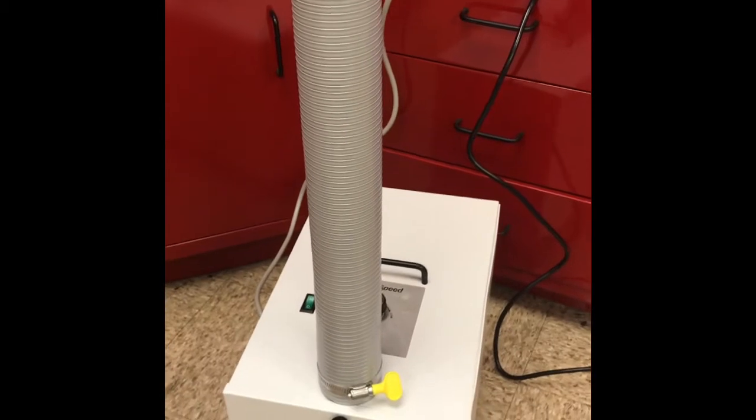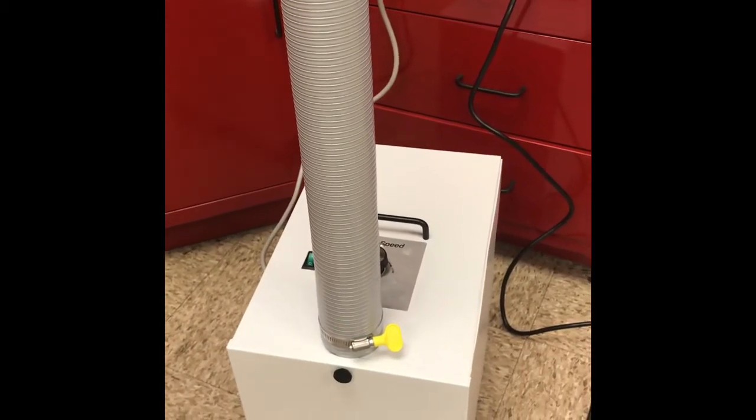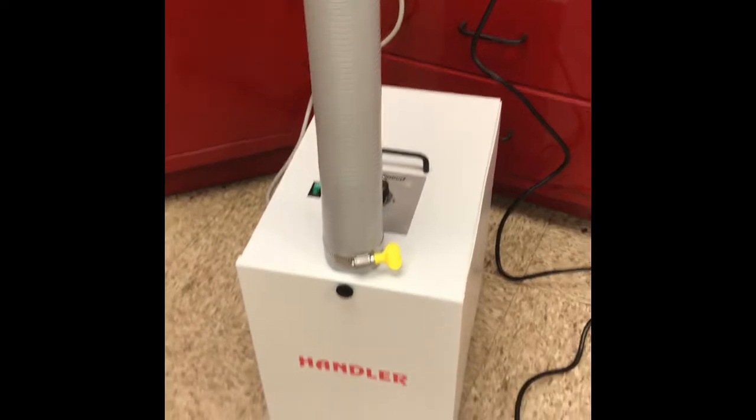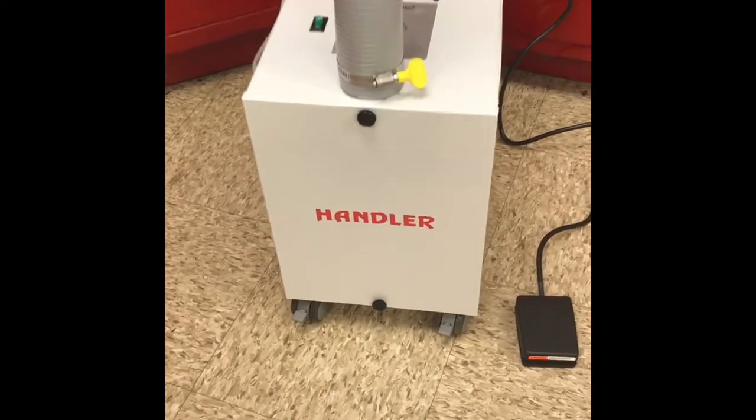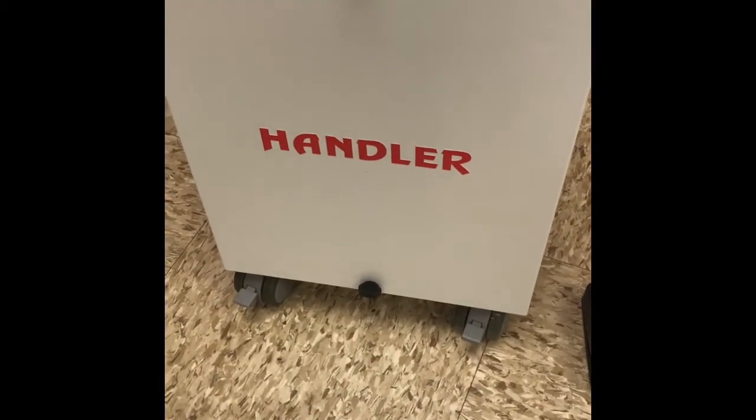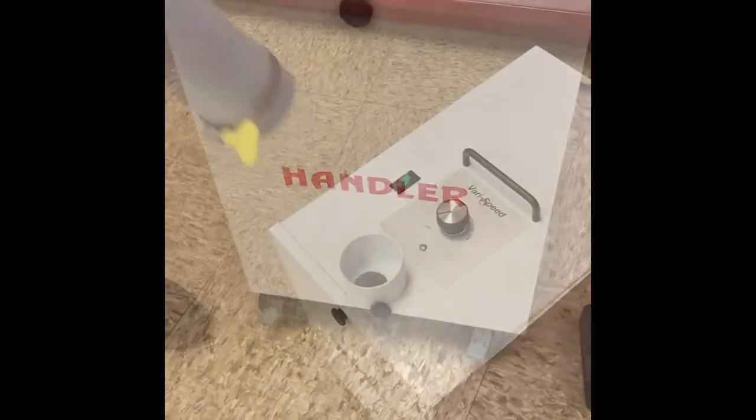You put the hose on the suction inlet and tighten the yellow clamp tightly using your hand. When the unit is in place, there are two lockable casters that you will lock so the unit will not roll off while in use.